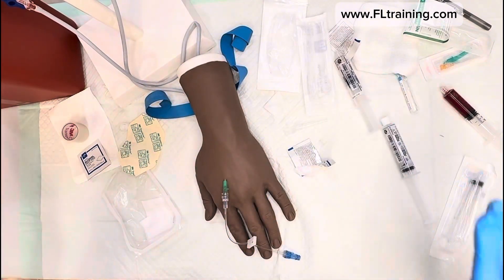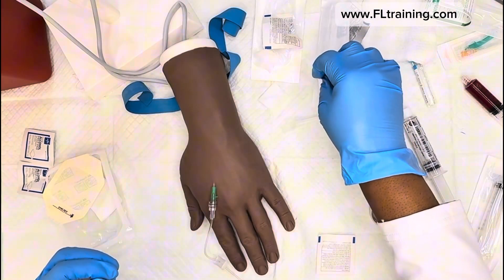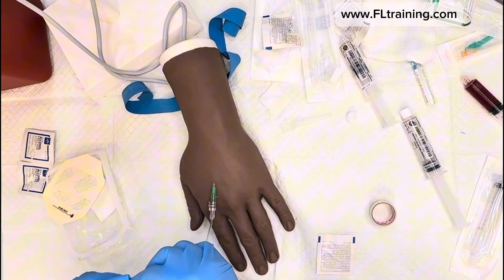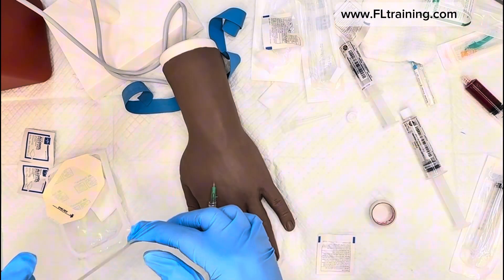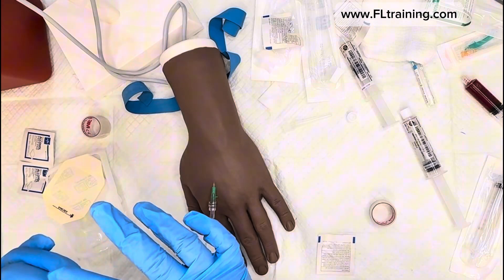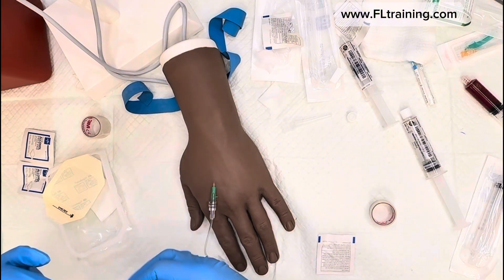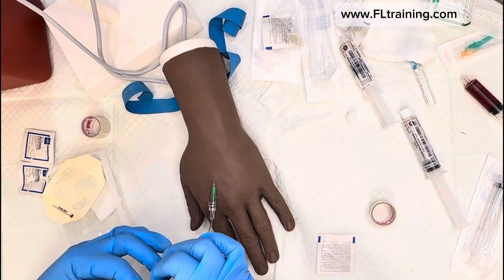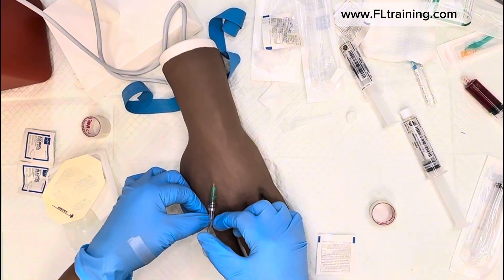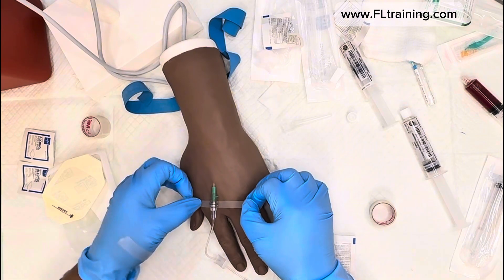Our patient did wonderfully. Let's start the tape process. You might wonder why I didn't pull tape off earlier — tape sticks to everything, including germs on the table, so I usually don't prepare it until last. However, if you have a patient who moves a lot, you probably do want to prepare your tape first.